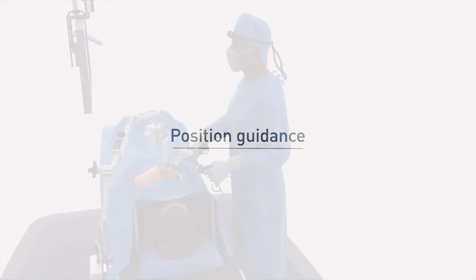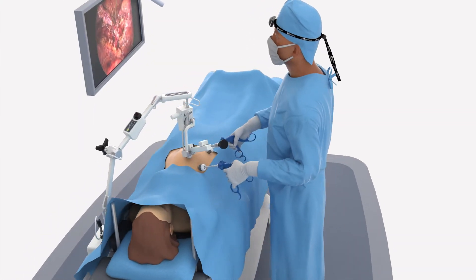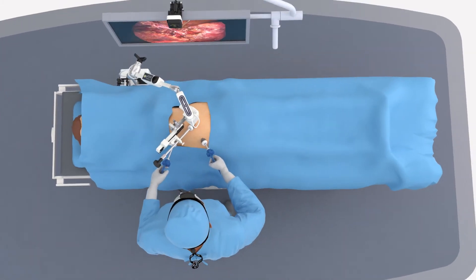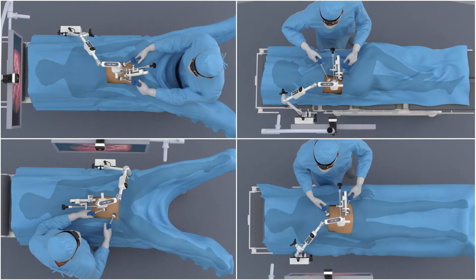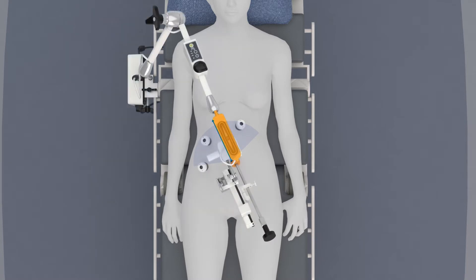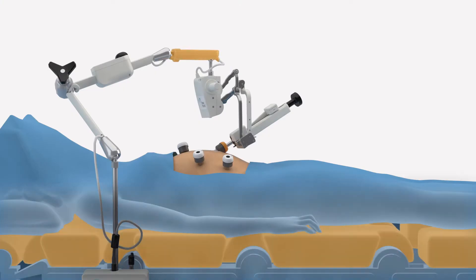The positioning guidance is designed to help decide how best to place the Freehand Collaborative Robot for each patient. The position of the patient on the operating table can vary depending on the type of surgery, which will decide where the surgeon stands and where the freehand cobot is best placed. The surgeon defines the expected range of vision required from the camera trocar position for the operation and hence the resultant midline position. The last part of the freehand arm will be placed in line with this and parallel to the operating table.